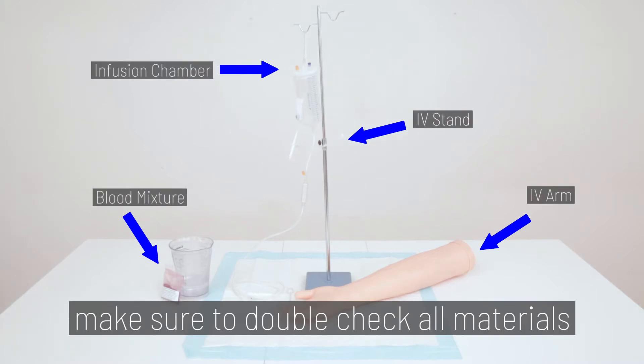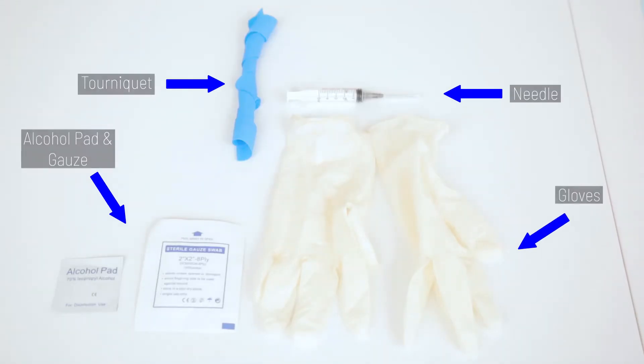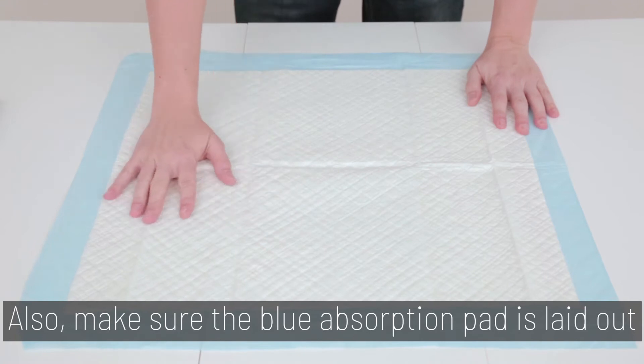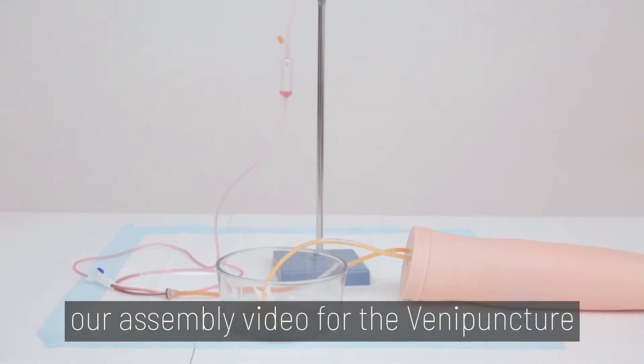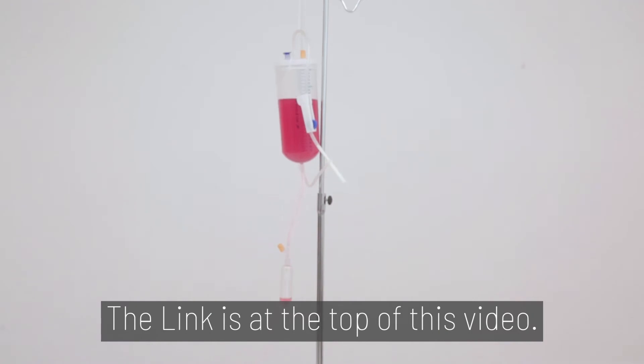Before we begin, make sure you double check all materials and read the instructions first. Also, make sure the blue absorption pad is laid out in case of any spills. For assembly of this product, please reference our assembly video for the Venipuncture Simulation Kit. The link is at the top of this video.